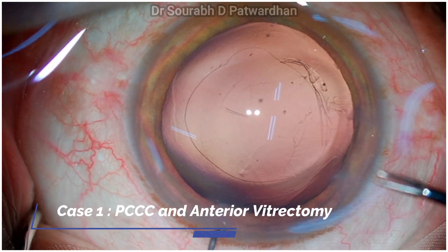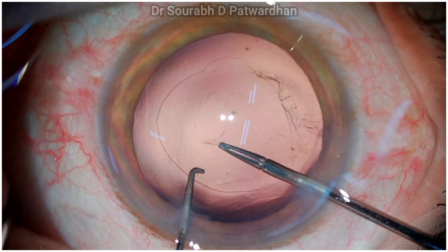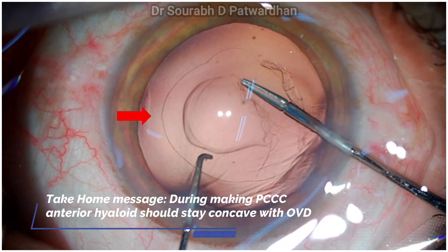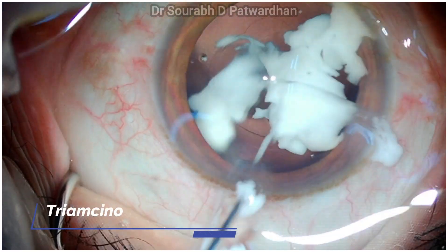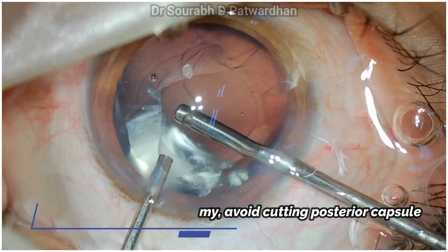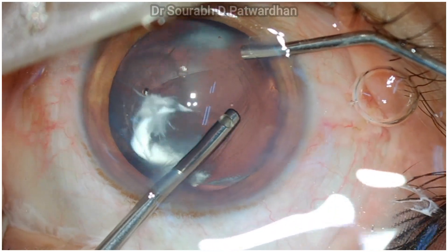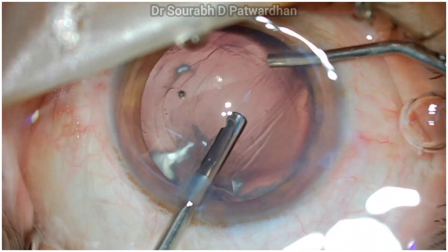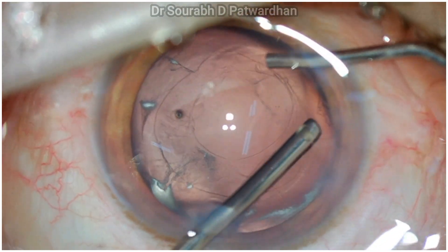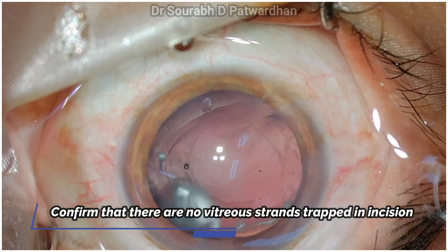Now I'll show how to convert a PC tear to a posterior capsulorrhexis (PCCC). If you have a small tear near the center, you can convert those torn edges into a PCCC — it is easier than you think. If there is vitreous prolapse, make sure you clear all the vitreous. Look at the torn rhexis edges where the contour is irregular and vitreous lies. You can sweep under the incisions to clear all vitreous from the chamber, ensuring no vitreous strand goes into the incision before you place the IOL.